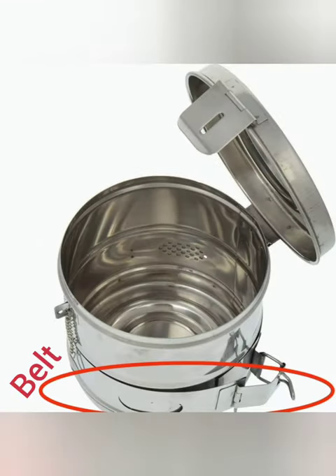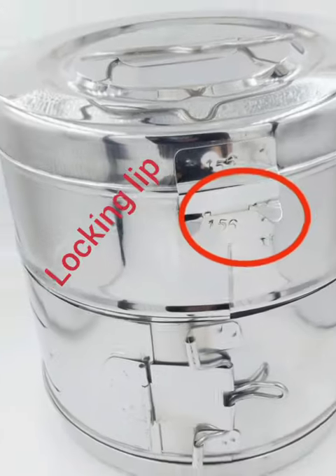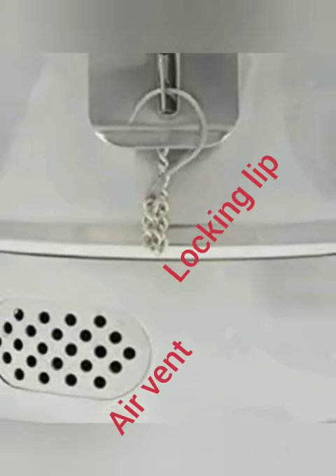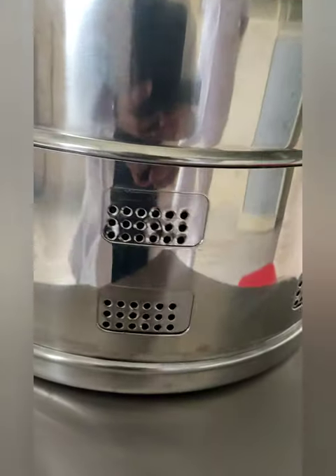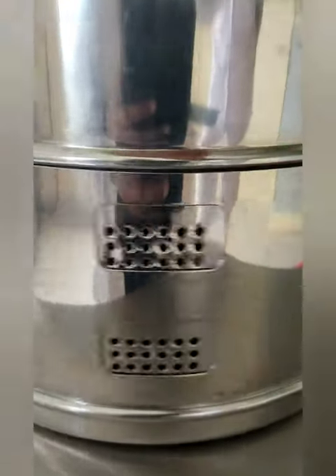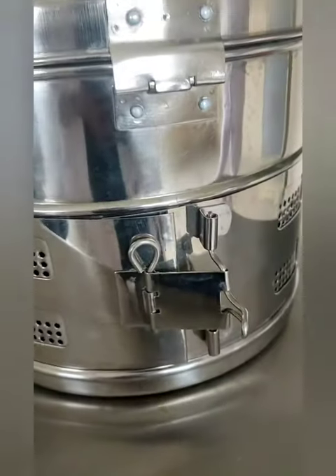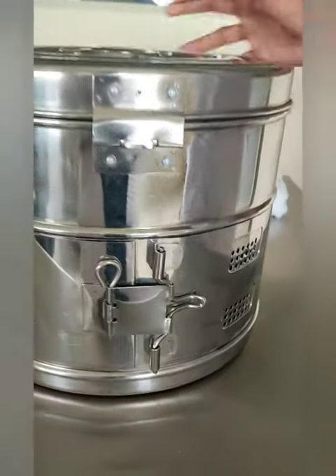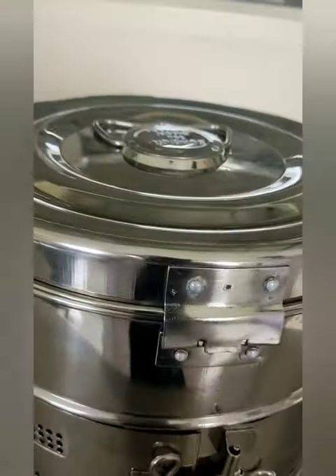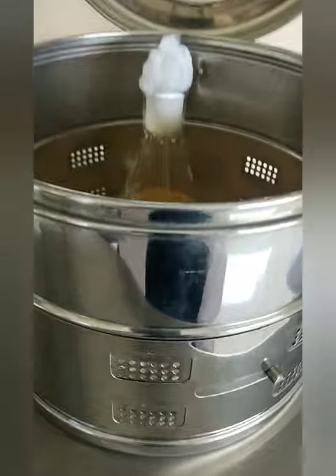the stainless steel belt, locking lip, and air vent. These drums are manufactured from high grade stainless steel and the lower body is perforated. They are offered with a snap fitting lid and are available in different qualities as well as sizes according to the requirement of the healthcare facility. The range of dressing drums available in the market are used to sterilize as well as store various types of dressings and hospital equipment.